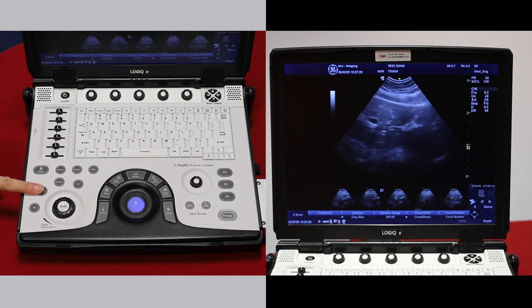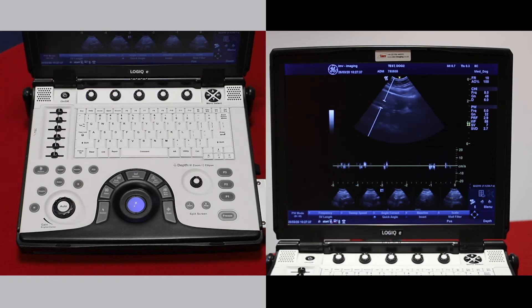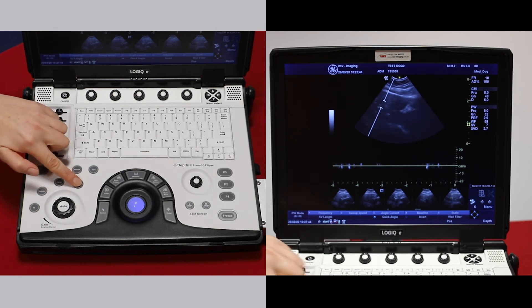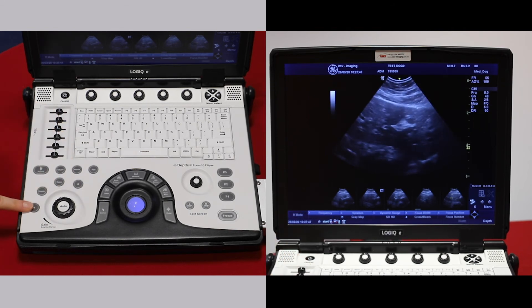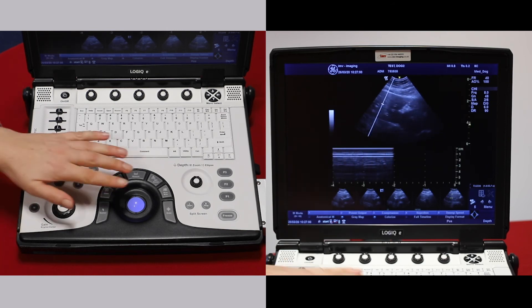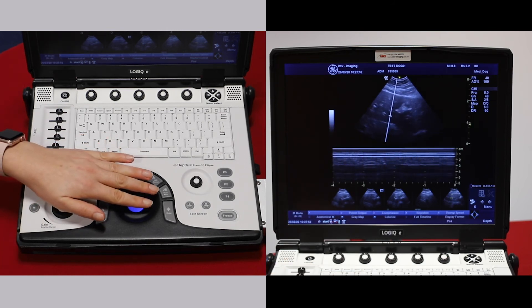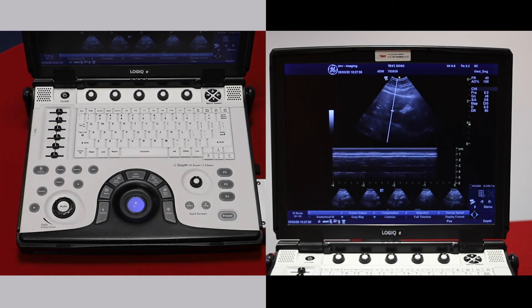Doppler is pulse wave Doppler. It gives you a gate to which to measure blood flow and a graph depicting velocity. M on the side here is your M mode. You can move the trackball to move the cursor and your graph is displayed below.